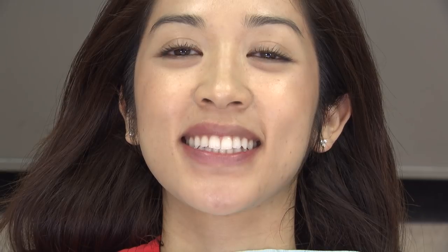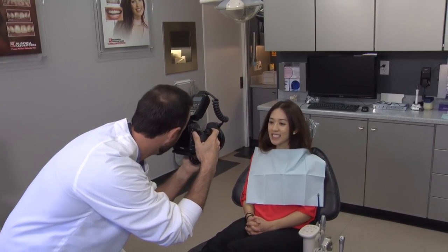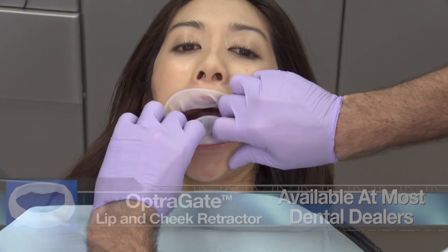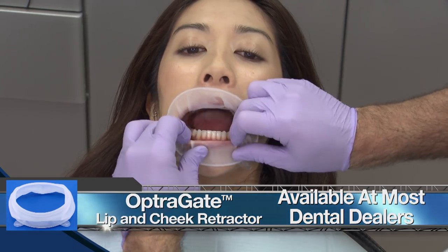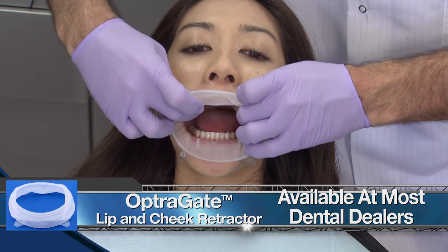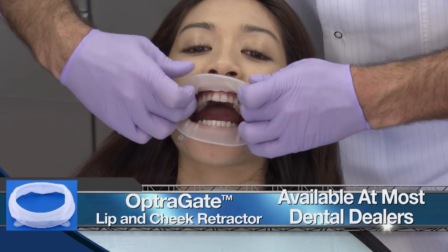A smile photo should always be taken with a natural smile in place. If the teeth are meant to be profiled more than a natural smile will allow, professional retraction devices need to be utilized instead of a forced lift of the lip or stretched appearance.